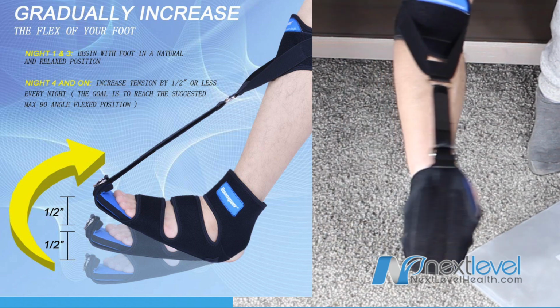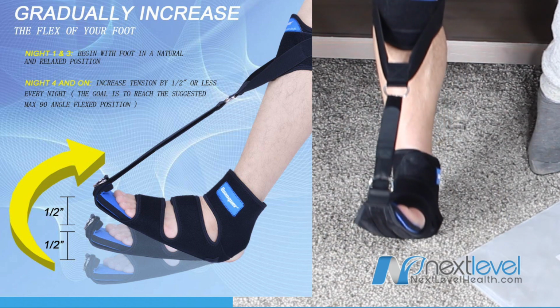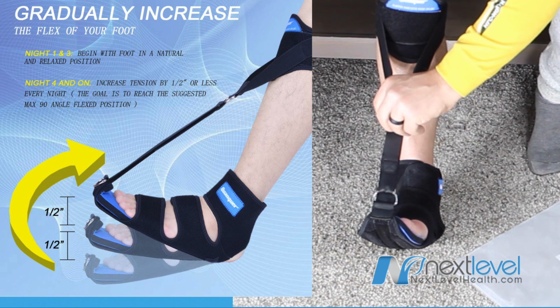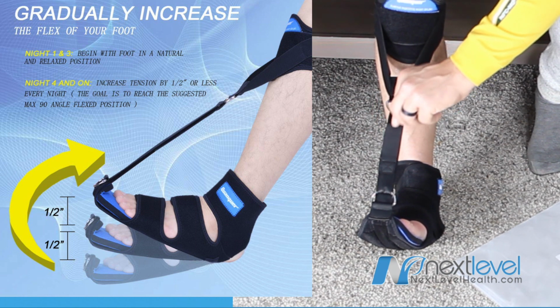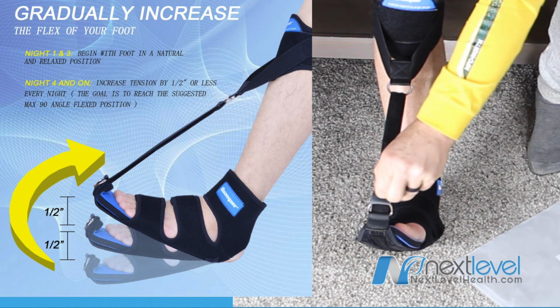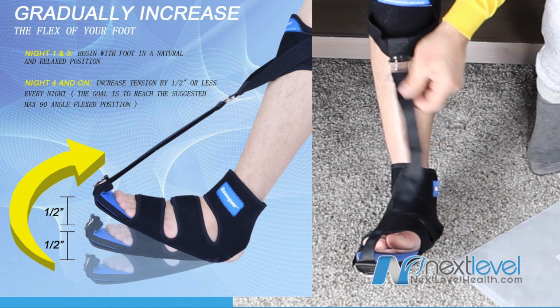tension. Remember to keep the tension tolerable, but not painful. And your goal is to be able to sleep with the plantar fascia brace comfortably while at max tension.